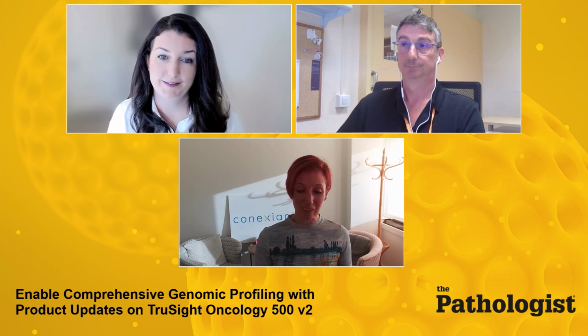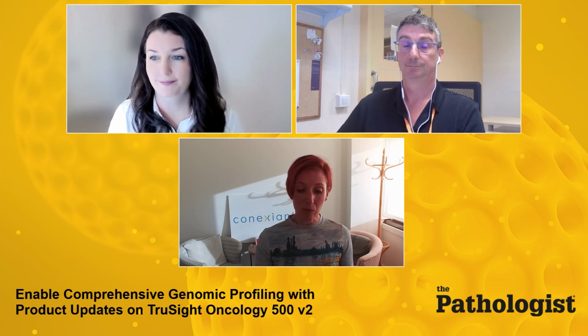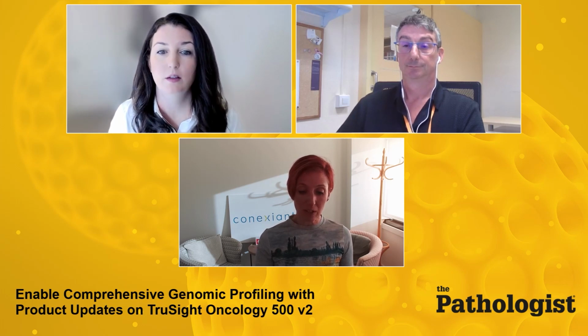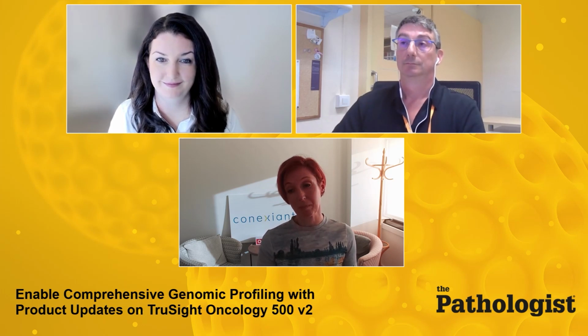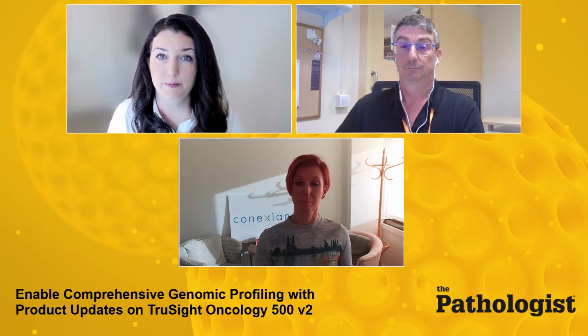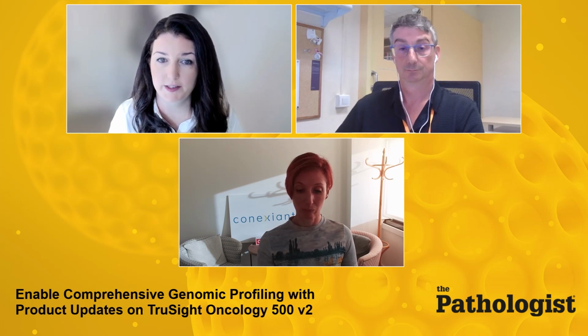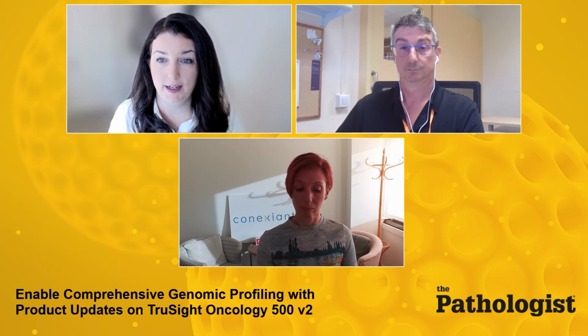Okay, and a question about the kits, Heather. Do you have both the TSO 500 version 2 and TSO 500 HT version 2 for DNA only kits? We actually just have one version of the V2 product, and it is compatible with all of our NextSeq instruments and NovaSeq instruments, and it's compatible with 384 indexes.